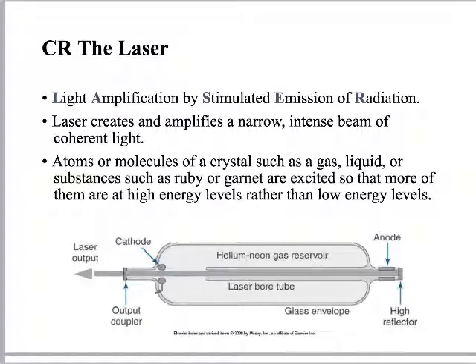They have some really weird rules, and I'm not going to get into all the rules of how lasers work. But the laser that we use for scanning CR cassettes, and this is a key term, is a helium neon laser. Helium neon gas laser. And that's important. It means it has a certain color. Specifically, its color is red, right? So we use a helium neon laser. Why? Because its color is red. I'll talk about why that's significant in a moment, but for right now, just know that it is going to be red.